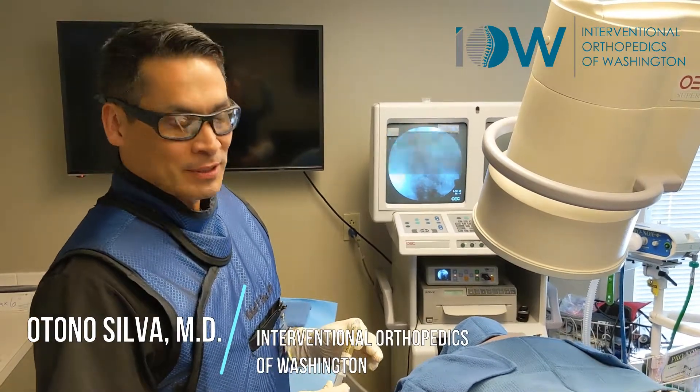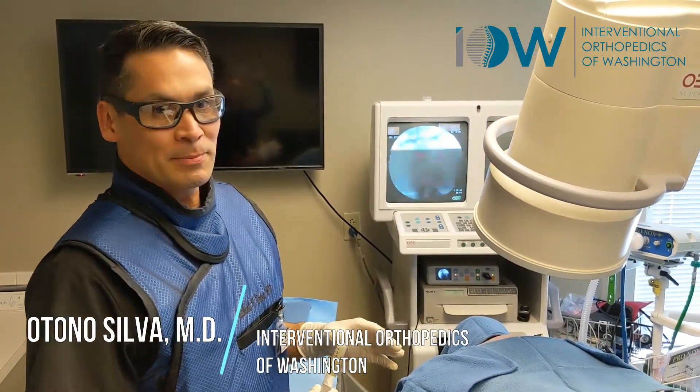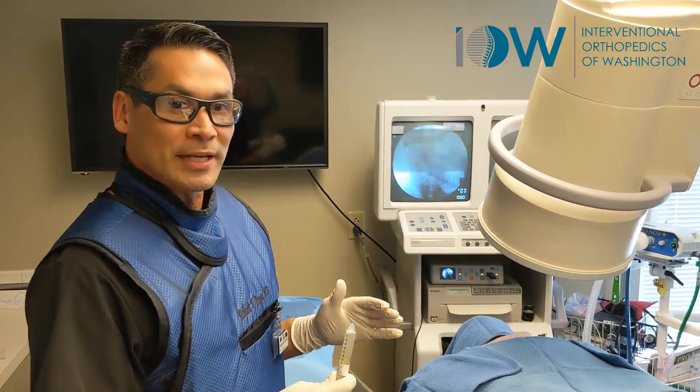Dr. Silva here. I'm going to do a PRP injection into the lumbar spine and cervical spine. We're treating the whole functional unit.